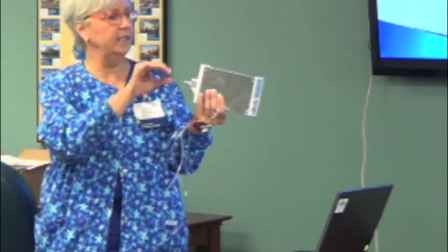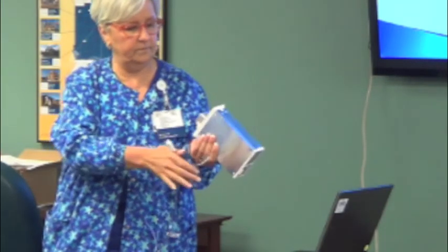As soon as you push this in, just like your other modules for blood pressure or heart rate or anything, the monitor comes on. It might ask you to calibrate, and then you just follow the directions on the screen on how to do that. So, easy peasy. I don't know if anybody wants to see that. There's just a little tiny thicker part here on this one for the reservoir for how it monitors exhale. Of course, it's not going to do quite as well with someone that breathes through their mouth.